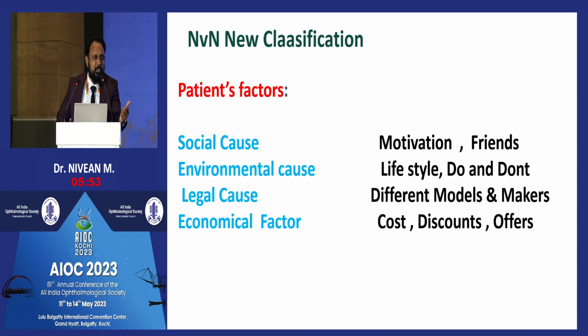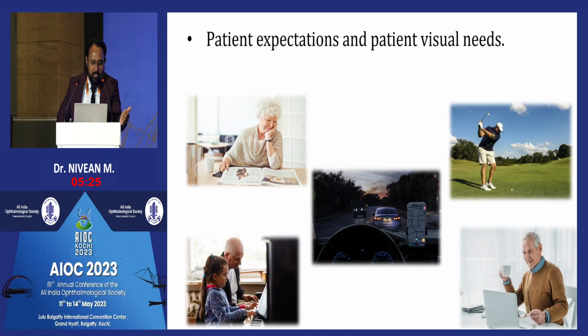And most of the patients, we know, come saying that my neighbor has got this or my relative has got this. So they also know about the advantages of those things and how happy he feels, and that puts us under pressure. Then the other things, like the lifestyle of the patient, what are his do's and don'ts. That is why customization is the key word here, and it is not one size fits all. So customization is the key for choosing the right IOL, I would stress here, because different models are there, different companies are there, and the other factor as far as our country is concerned is the cost also. So what I meant is that extra chair time is very important.